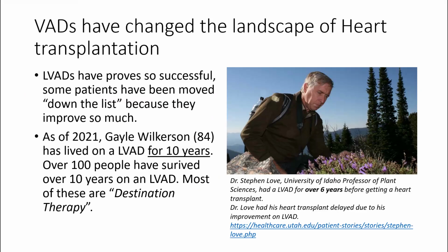As I said, this is the gentleman who was so unstable, he received an LVAD with the idea of just buying him time to make it to heart transplant, and he did so well. He did so well that he had his LVAD for 6 years. This gentleman is a professor. He's a botanist at the University of Idaho. He's very active, and even with his LVAD, I have other pictures, but they weren't that good, of him out in the field doing his thing with his LVAD kit on him, so on and so forth.